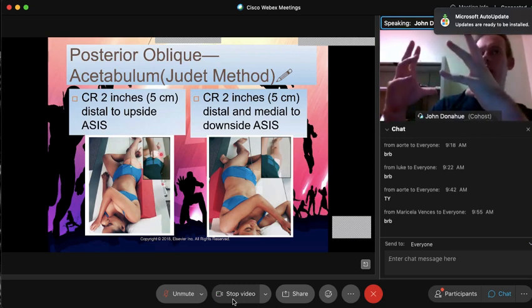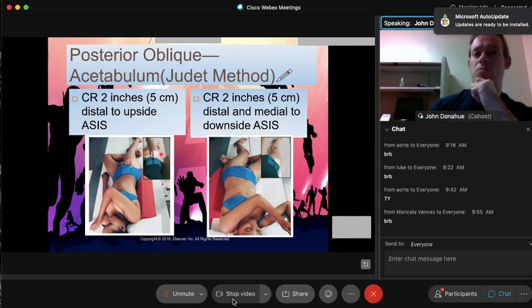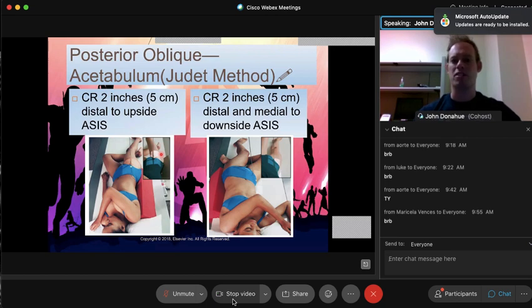And that's going to open up that acetabular area once again. Not done too often. They will order these every once in a while. They really suspect there's some major fractures going on real deep inside that hip joint within the acetabulum. That's why they would order these. Otherwise, most of the time you can visualize it just fine on a normal AP and lateral hip or pelvis x-ray. This would be more of those specialized views they may order. This one's specifically for the acetabulum. Main thing to remember there, guys, if the registry was going to ask you a question on this, it would be, why do we do a posterior oblique Judet method view of the hip or pelvis? You would say to visualize the acetabulum opened up. That's the main point I want you to know on that view right there.